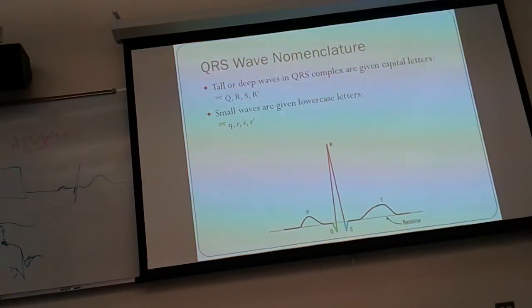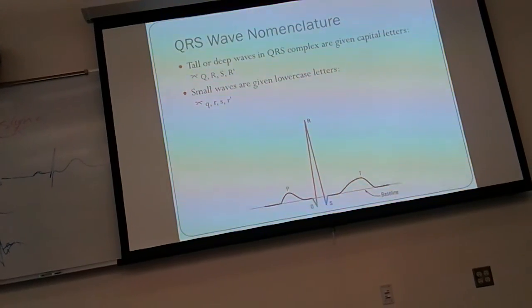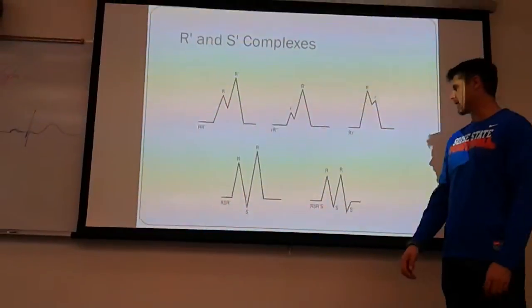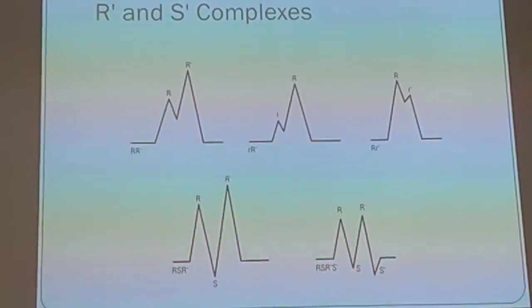Okay, and so our QRS complex is right there. Yay for the QRS complex. You can see all kinds of different possibilities that are there. It can come in many, many different shapes, many, many different ways.